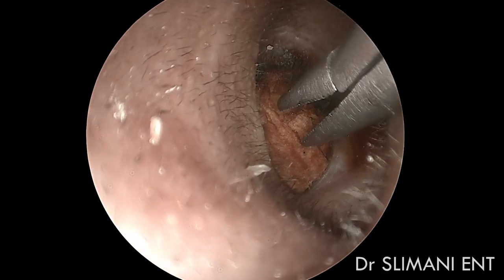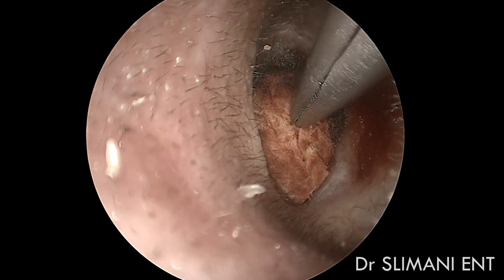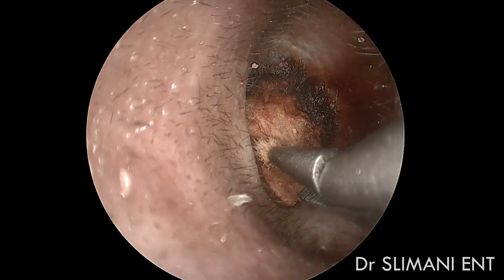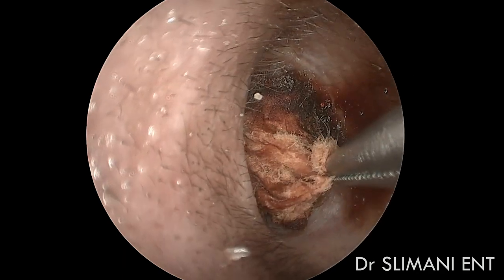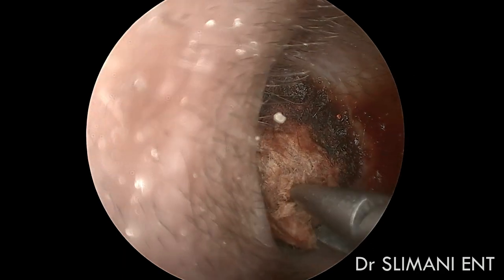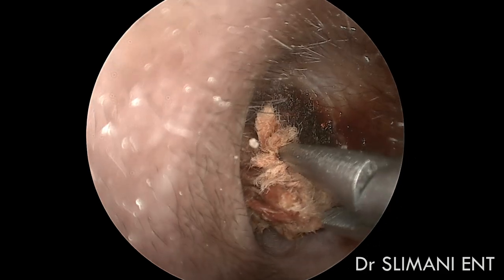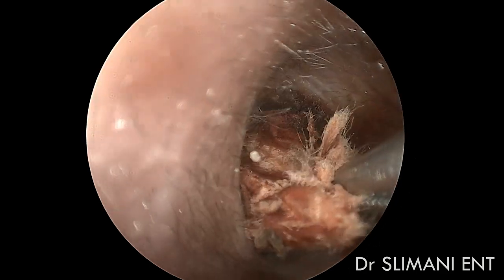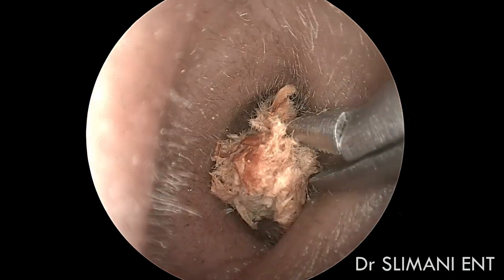Hello everyone. This case is about a lady who presents an ear fullness sensation and hearing loss of her left ear. The foreign body appears to look like a cotton swab. We perform the extraction with crocodile forceps under camera vision.